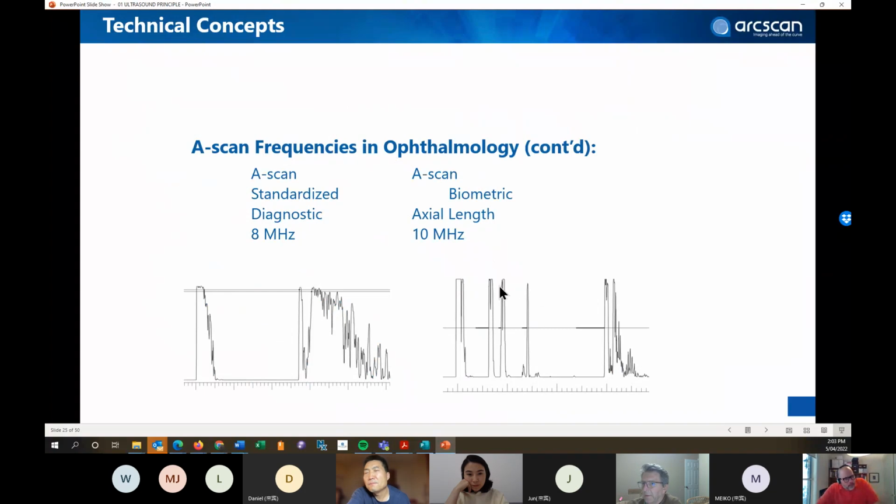Yes, very sharp peaks. This is one A-scan, and you can measure where the peak is. For example, this is highly exposed; the gain here is too high, but this is normal because you have high gain at the beginning and then it attenuates, usually because of a cataract.